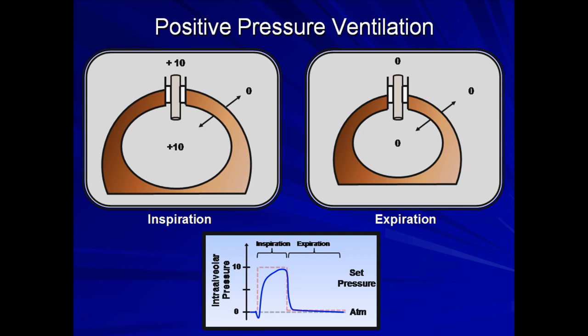Before we move on, I want to point out that what I've shown you with these schematics and graphs is a substantial simplification of the actual process. Respiration doesn't happen in a sequence of well-delineated steps like I went through, but rather as a continuous smooth process. Volumes and pressures change simultaneously, not in a series like these animations might make it appear.